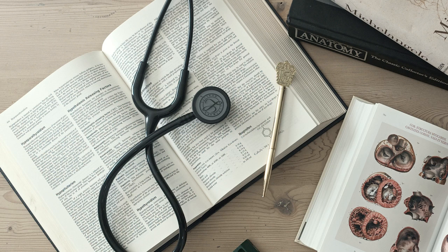Got it. You see an initial R wave, a deep S wave, then a second taller R wave, the R prime. In the left-sided leads like V5, V6, and lead I, you'll often see a wide, slurred S wave, reflecting that late right ventricular depolarization moving away from those leads. In essence, with RBBB, you have a widened QRS with that classic RSR in V1, V2, and wide S waves laterally. What's the clinical picture for bundle branch blocks, and crucially, what's their management?